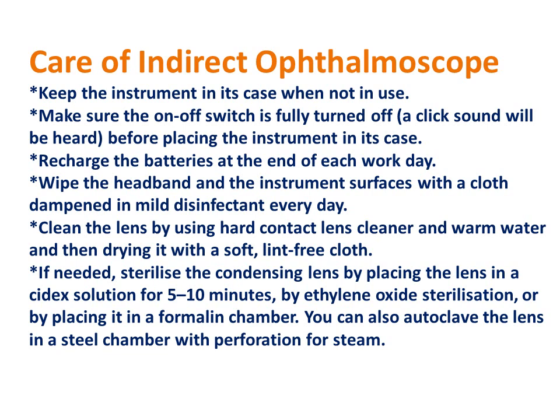Now we will learn something about how to take care of the indirect ophthalmoscope. Just like how you take care of the direct ophthalmoscope, our aim is to keep it very clean and see to it that the illumination part is not spoiled, so that the longevity or durability of the equipment is very long. Keep the instrument in its case when not in use. That is the regular rule.